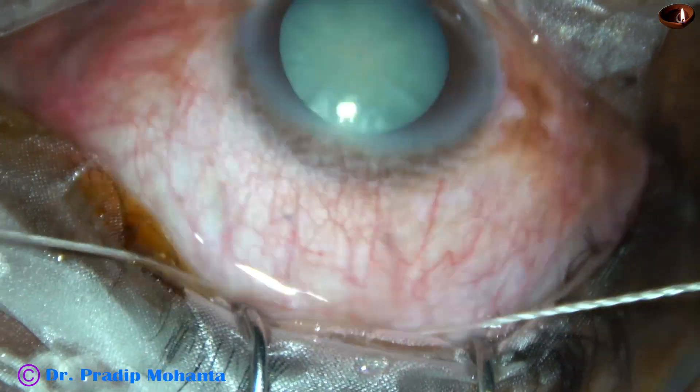The X suture comes through the groove. This is another bite taking both lips. The first bite is only from the groove to the posterior lip. This is just pulling the thread. This video is totally unedited and you are not missing anything. Now this is the third bite on the anterior lip — just come out.